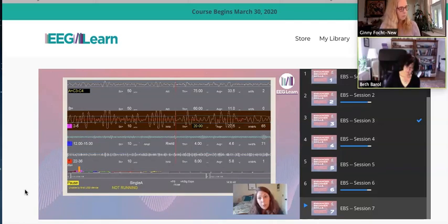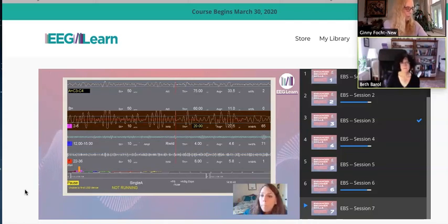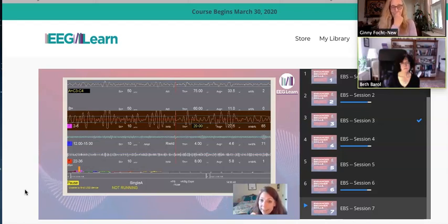And that percentage can help me know how hard or easy I've set that limbo bar. So again, if a 35% inhibit on slow wave activity is moderate, we've narrowed the threshold and lowered the limbo bar so that more of that activity is outside the threshold. So they're going to have to bring the difference in that activity down more than they have been to get a beat. Right? And that's the thing with C3 minus C4, when you have a bipolar protocol, those two sites have to check in with one another and coordinate their activity differently than they have been doing to get the beep and to get the game to go. Okay.